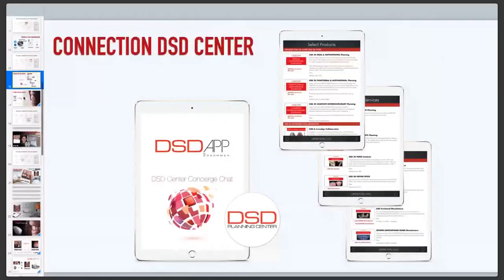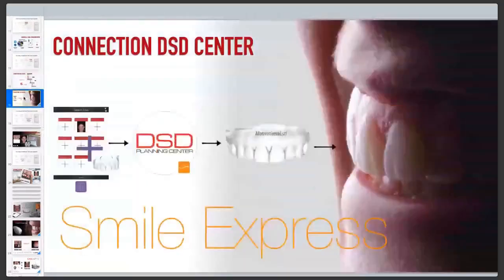And we are also going to have a new product released by the Planning Center very soon, which is the Smile Express. It's basically one photo and one STL sent via the app. The Planning Center, within 48 hours, is going to have the shells or the model delivered to your door for the patient mockup. So it is an interesting option for some cases where you decide not to do your own digital wax-ups in the app, right? So you're going to have both options. You can do it yourself, or you'll also be able to send it to the Planning Center.